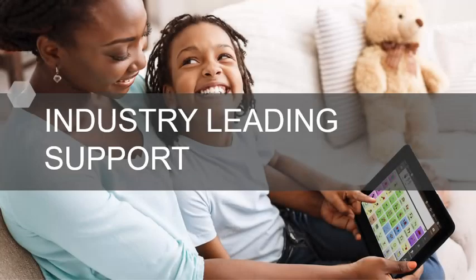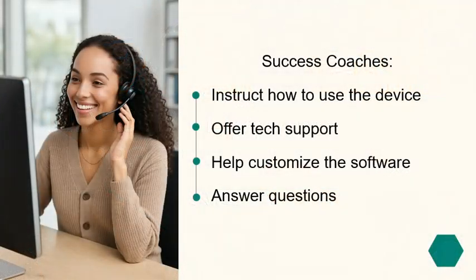EyeTech is proud of its reputation of providing unmatched customer support. A success coach will connect with you in a virtual meeting once you have received your device. We'll go over the basic use of the tablet, help customize the software, and answer any questions you may have.